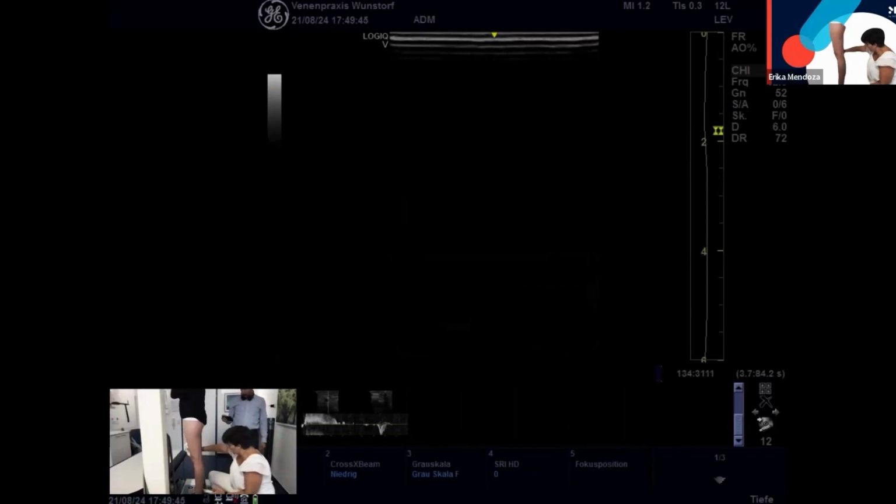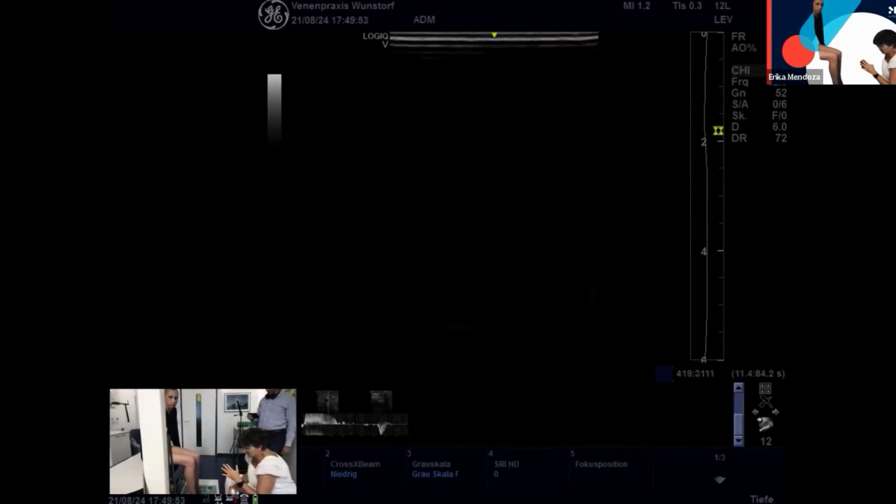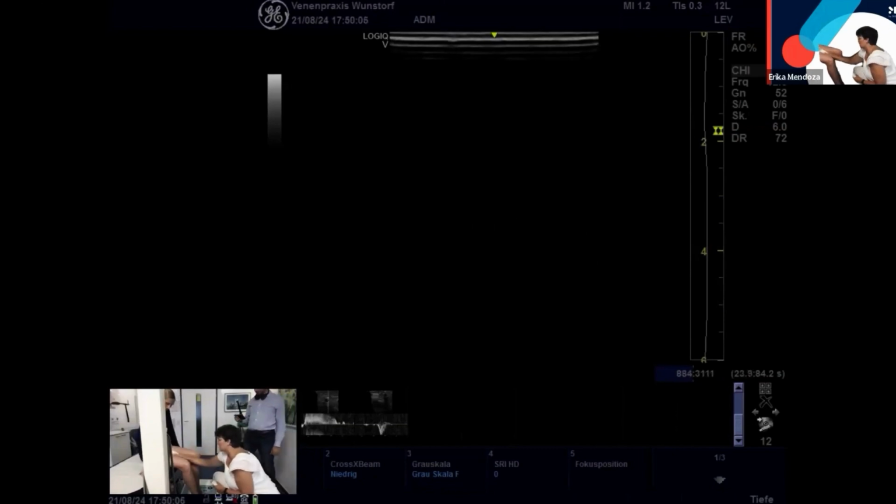Perfect, yes. So I will do a sclerotherapy because in my experience it is the less harming. You don't have to open the fascia to reach the venous system to do a surgery. And this is the less harming option. In the same session, I can close the perforator and solve everything down to the calf, and the lady will have a cosmetic result with one session of sclerotherapy. She will wear stockings, of course, for two weeks afterward.